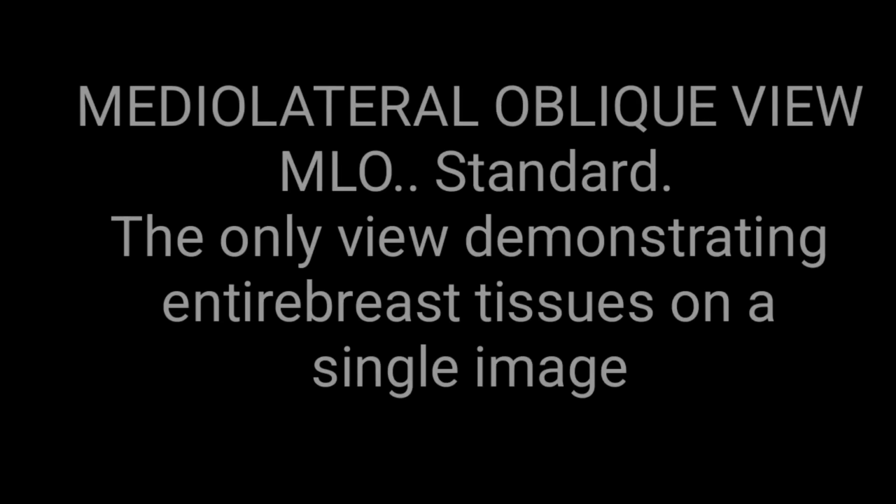What happens with the MLO is the X-ray beam is directed from superior medial to inferior lateral, usually at 30 to 60 degree angle, and compression is applied obliquely across the chest wall, perpendicular to the long axis of the pectoralis major muscle.